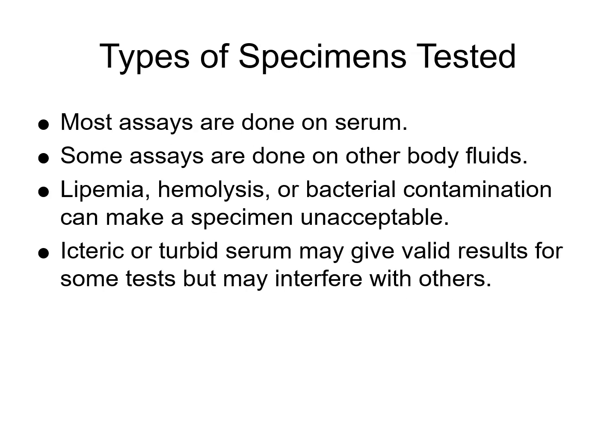For specimen types and acceptability, the purpose is to understand which specimens are appropriate for serology testing and to also recognize factors that may affect test accuracy and specimen acceptability. So different types of specimens. The primary specimen is usually serum. That is the most commonly used specimen for serology assays. Some alternative specimens may be other body fluids. It's going to depend on the test protocol. Some examples of that could be your cerebrospinal fluid, synovial fluid, and urine.